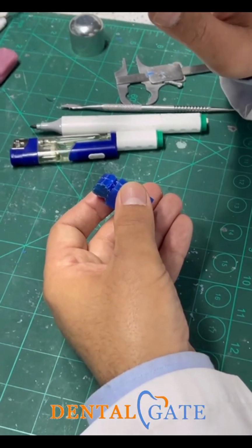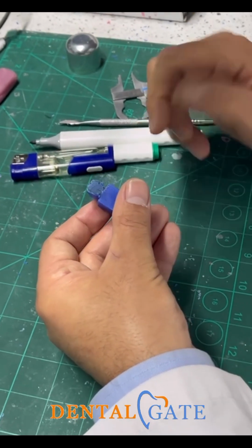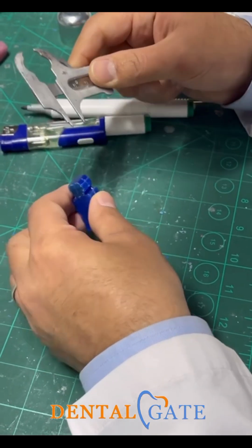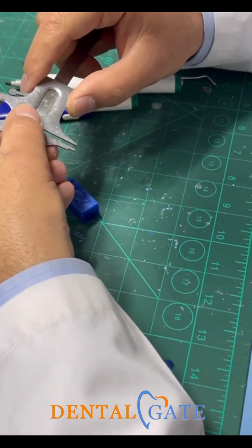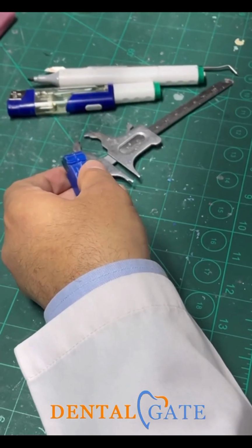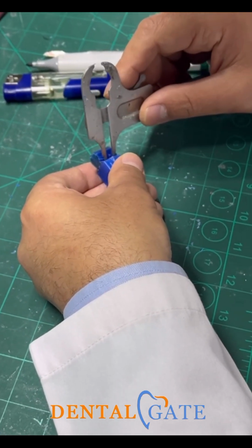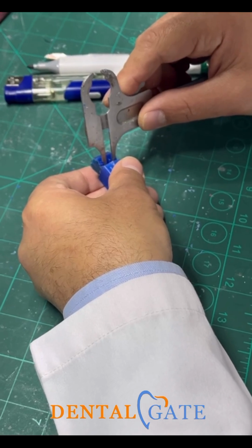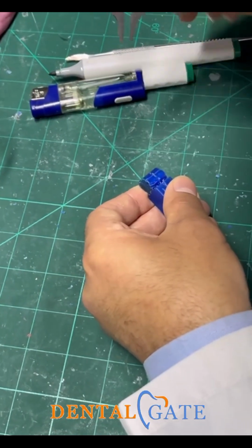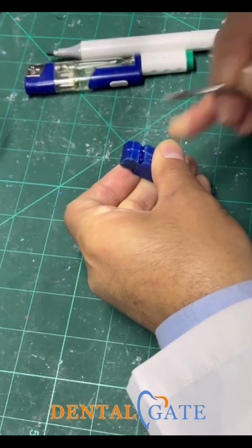It's not different because I will add the carving, add the features. So at the cervical, I need only what? 5 millimeters. And first, assign 5 millimeters here. And regarding the bisecting line, assign only 5 millimeters. That means you need 2.5 on each side. Okay? This is my 5 millimeters. One here, one here. Okay?